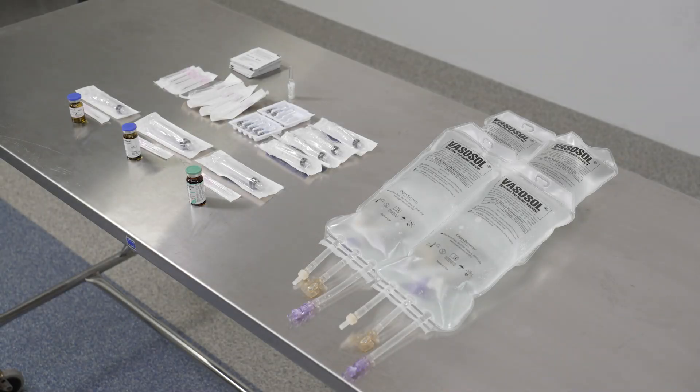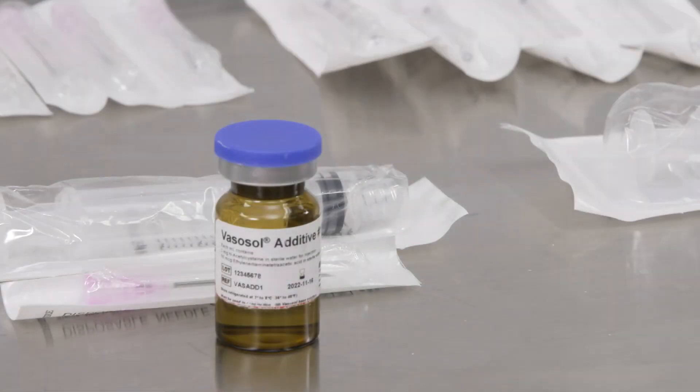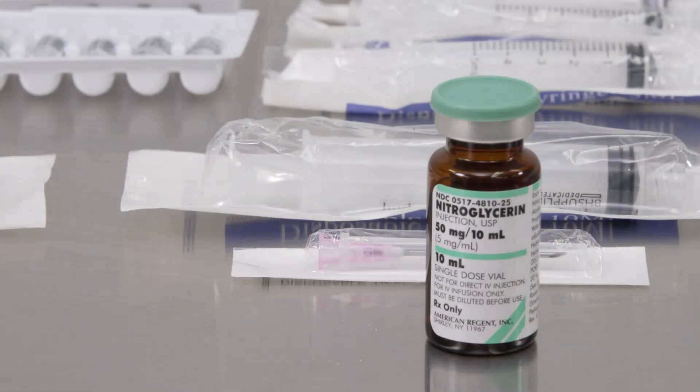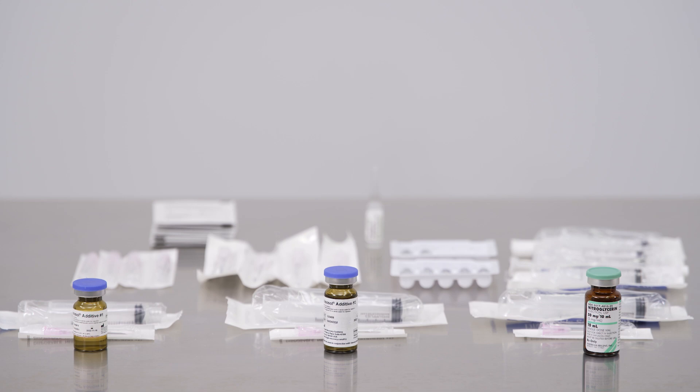To prepare a vasosol solution with additives, start by assembling the following: four one-liter bags of vasosol, additive number one, additive number two, nitroglycerin, eight ampoules of alprostadil, the necessary sterile syringes, needles, and filtered straws or needles.